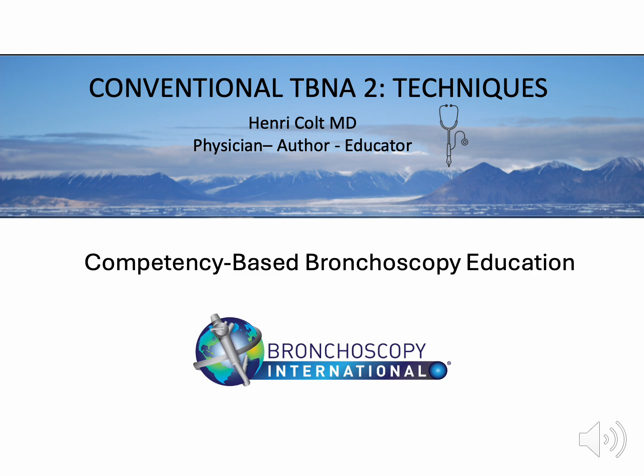In this lecture, we will review the practical techniques used to perform conventional transbronchial needle aspiration. We will discuss methods of needle insertion, sampling of common mediastinal lymph node stations, procedural planning, and practical strategies that improve diagnostic yield while maintaining patient safety.